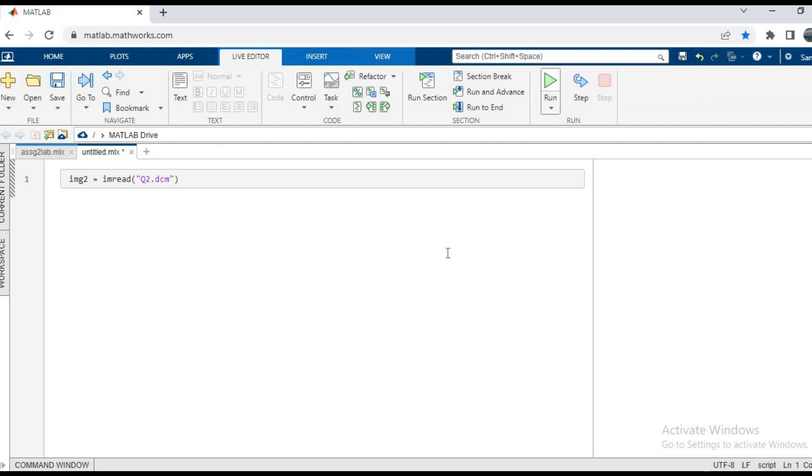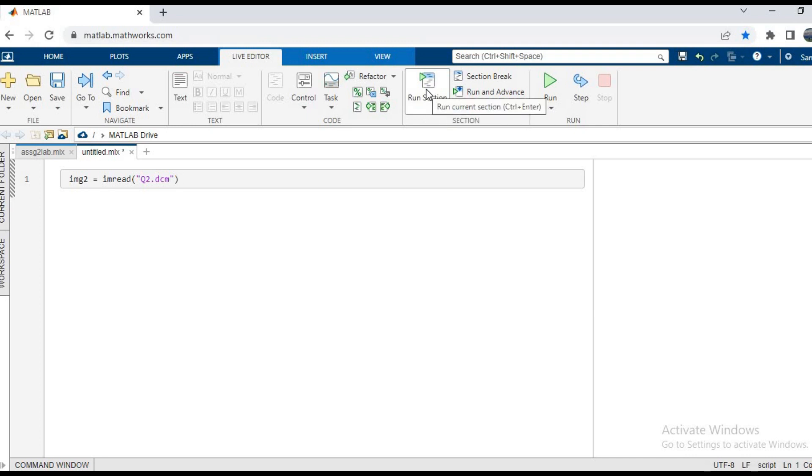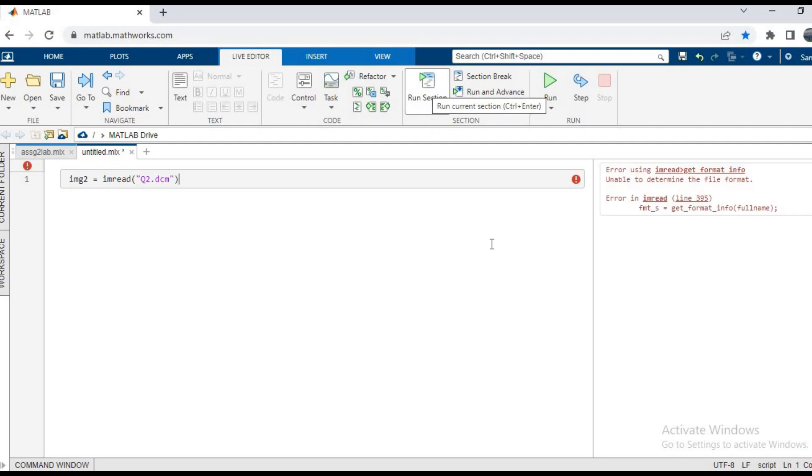Now to run this code, we have two options, and that is run or run section. In this one, I am going to choose run section and let's see what happens when we do it. So now you can see that there is an error in the imread function.